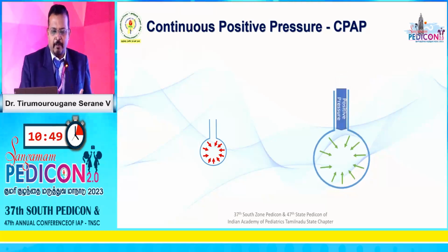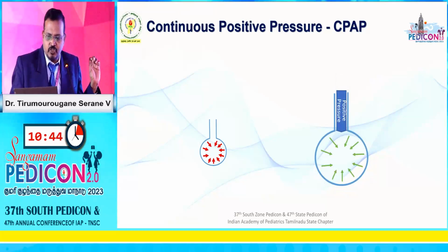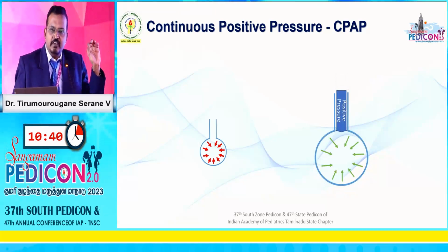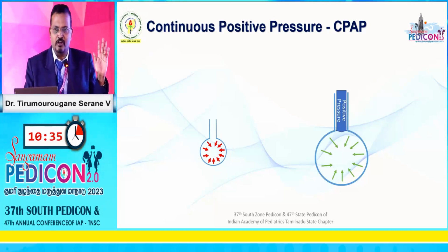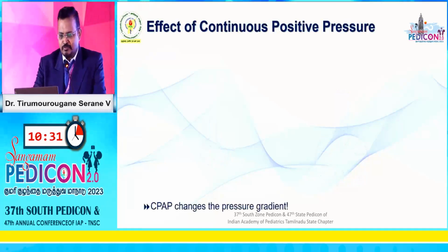Now, just see what happens when we give a positive pressure. The tendency to collapse is much lower, and the pressure to collapse is even lesser. These are all based on the Laplace principle. I just don't want to bore you guys, but I'm happy to discuss independently if anybody wants to.